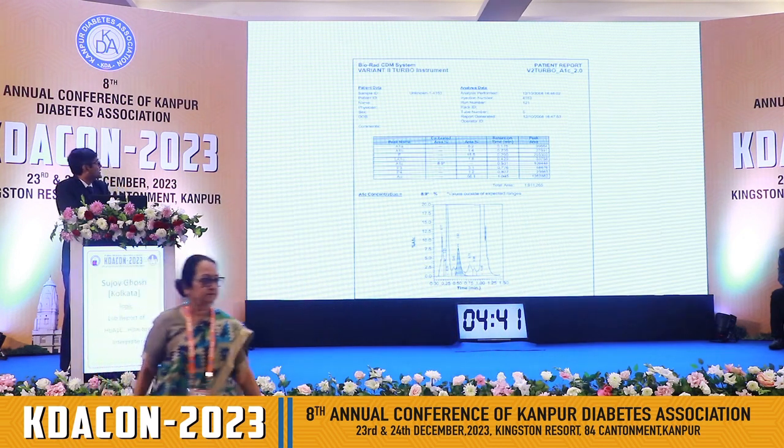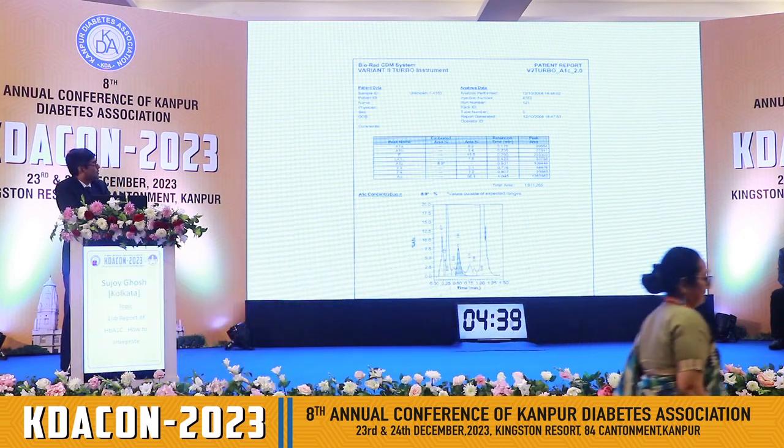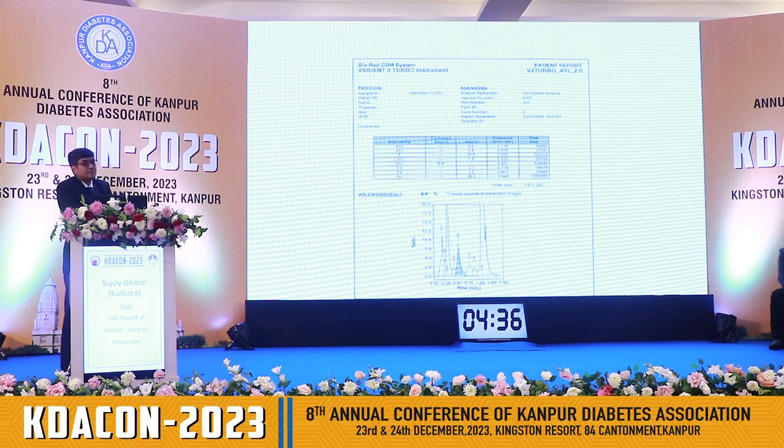And then if you look at this particular one, you can, I don't know whether you can make out, F says 15.5%. I've already told you the fetal hemoglobin has to be less than 10%. If it's more than 10%, the report is not interpretable.